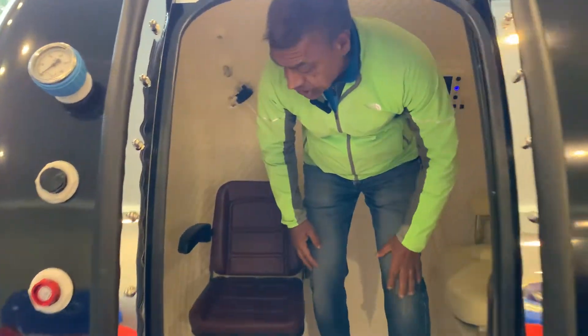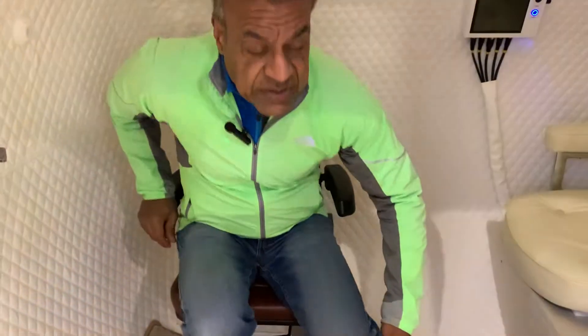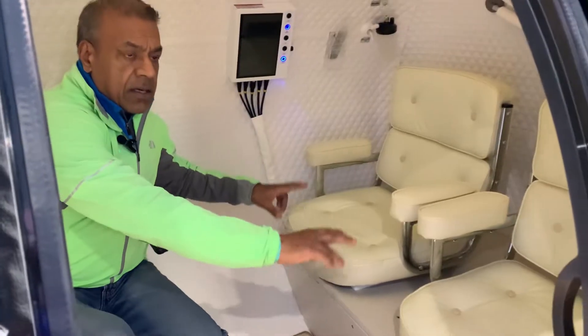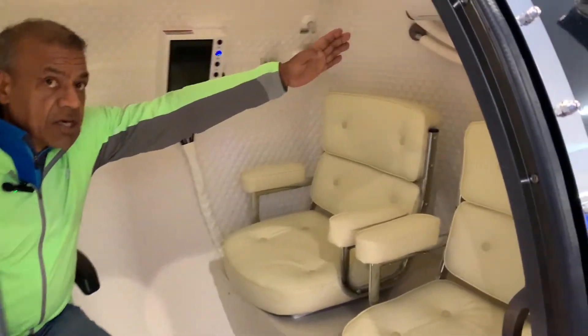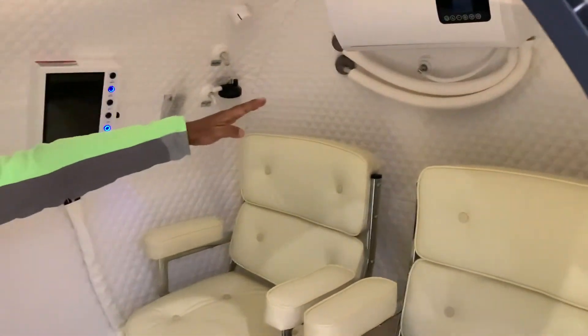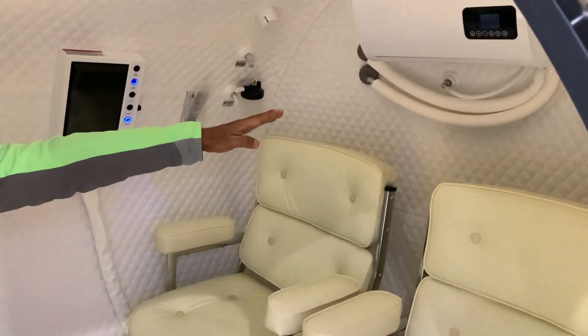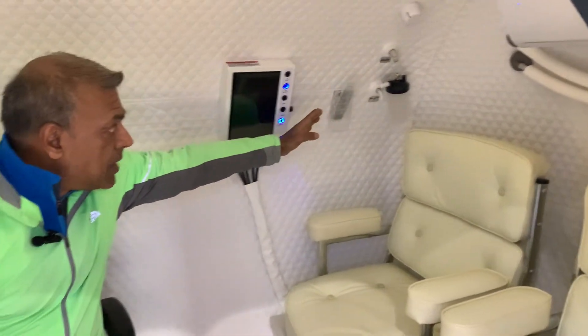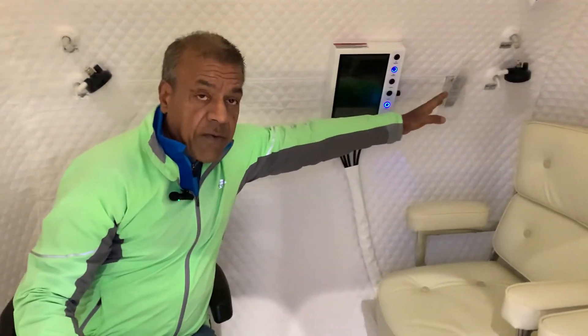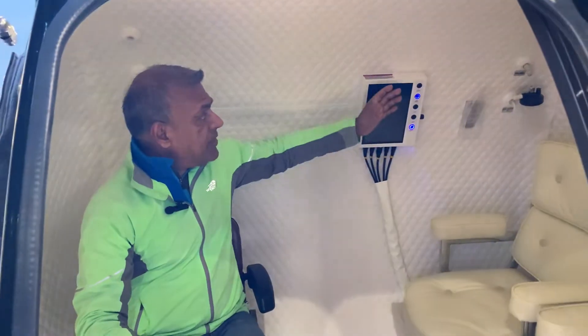Here is the interior. We have two standard customizable seats right here. On this side you'd have the internal AC and the tubing for it. You have the sensors and the condensation cup. Remote control for your TV — we'll go over that in just a few seconds. Then you have the internal control panel. Whatever you can do from outside, you should be able to do all of those functions from inside.